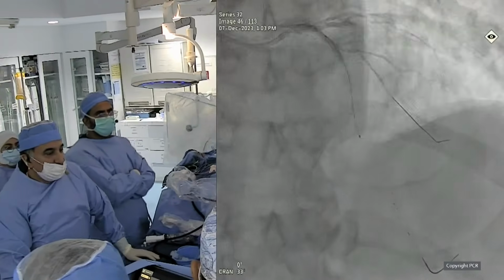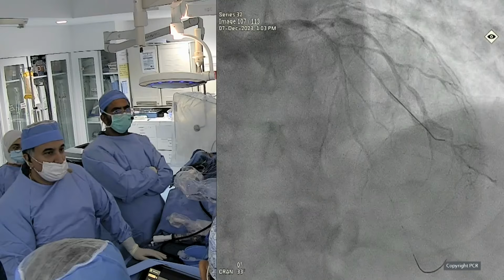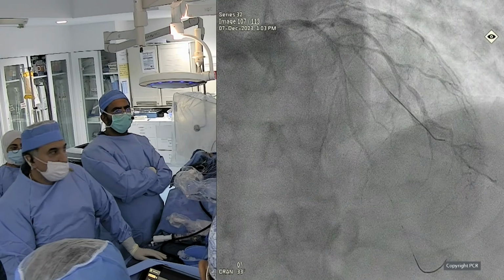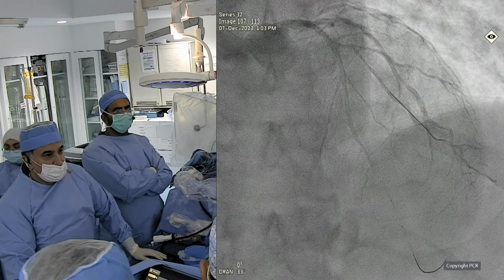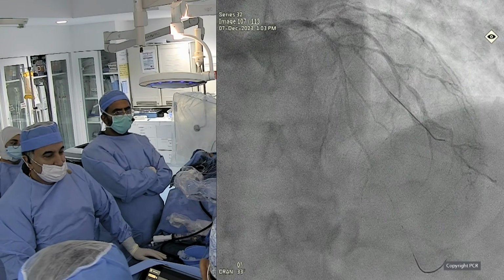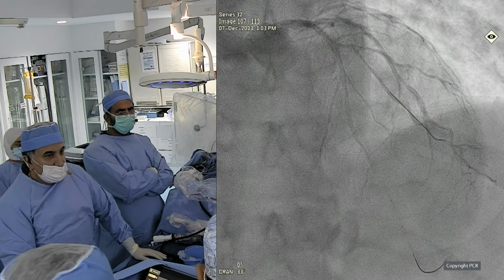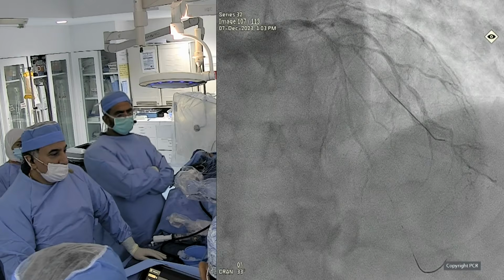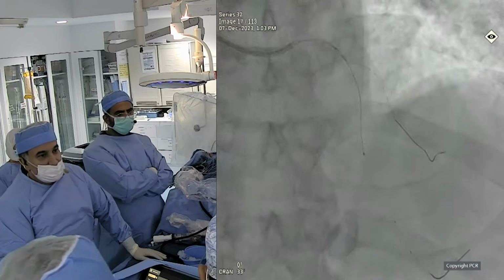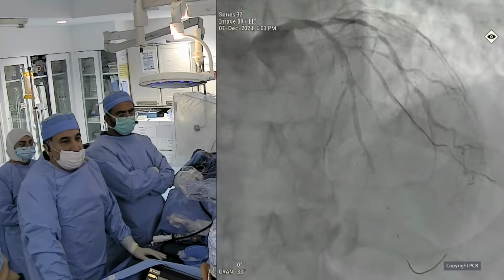We don't have co-registration. Okay, go back to the morphology. We're listening to your analysis over there as well, and you tell us what the next steps are and what you are utilizing the OCT run for at this present stage. Let's first start with the distal landing zone. Where is the best landing zone? At the moment we see the angio.